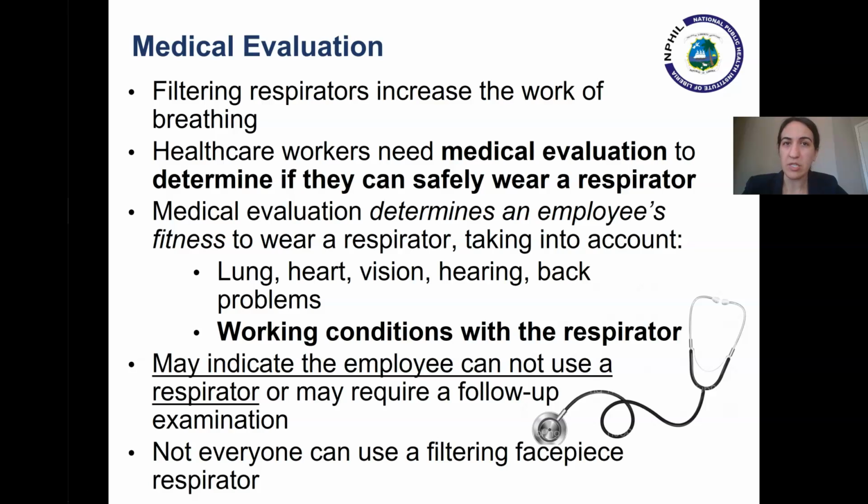The medical evaluation determines the healthcare worker's fitness to safely wear a respirator. Important considerations include any pre-existing health conditions the healthcare worker may have. Medical evaluations also take into account working conditions, as more strenuous activities will also increase the work of breathing. The medical evaluation results may indicate that it's not safe for the employee to use a respirator, and that's okay. Not everyone can safely use a filtering facepiece respirator. Those who can't should not be exposed to respiratory hazards unless they can use a powered air purifying respirator.